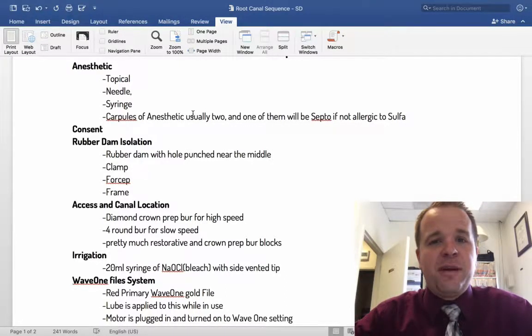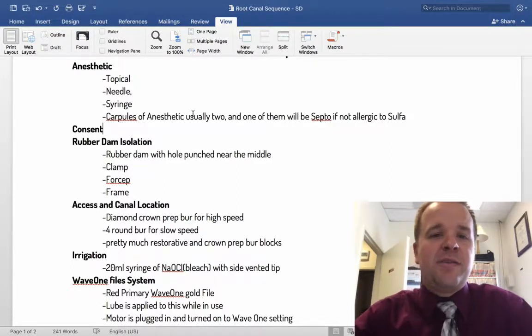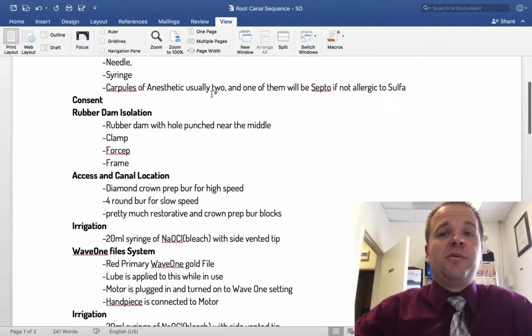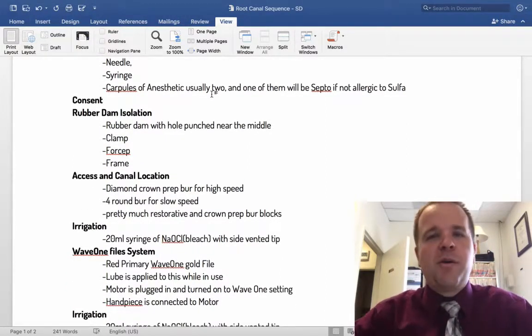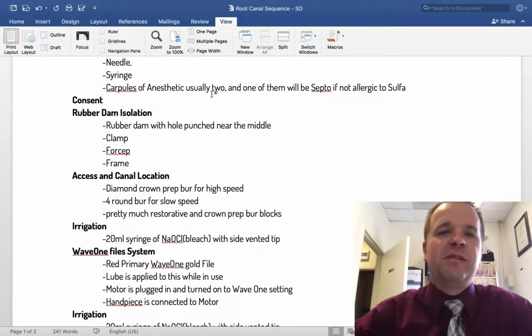And then you have the yellow that you'll do for the mandibular or the bottom jaw, and then you have the blue for the top jaw. And then just like with extractions, even though you're doing one tooth, you usually do multiple carpules because you want to make sure that the patient is really, really good and numb.